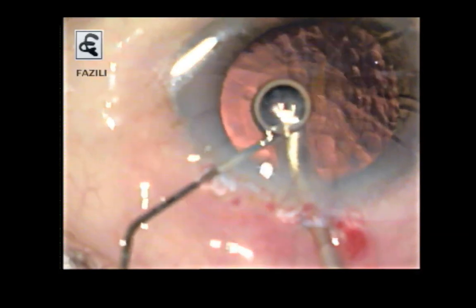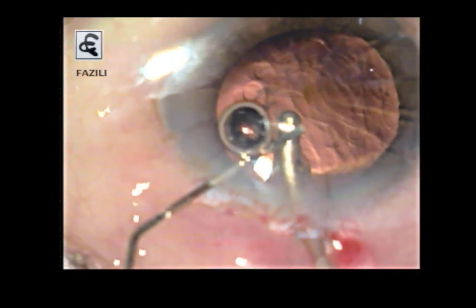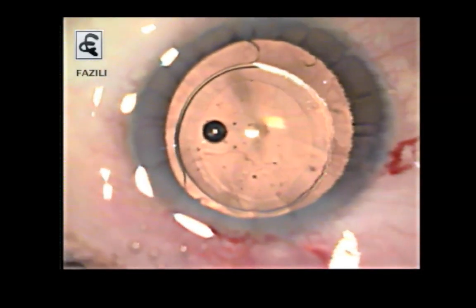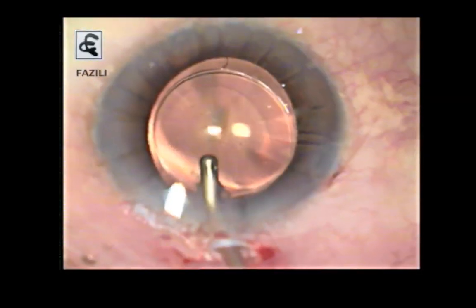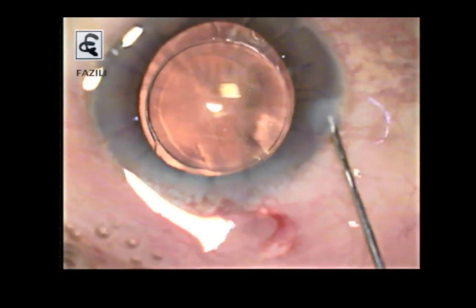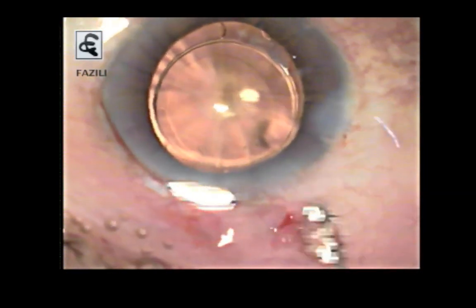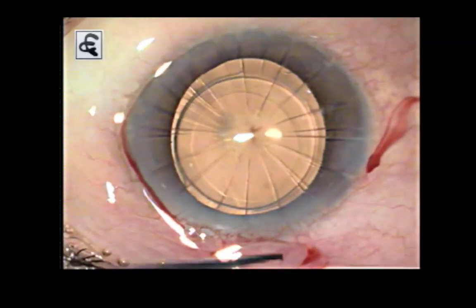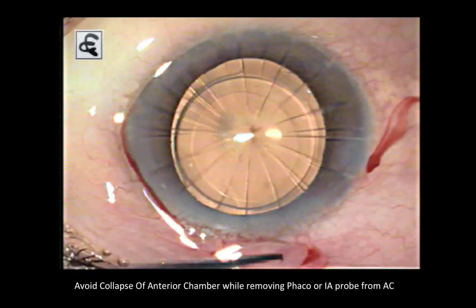So these people might not have very thick glasses. You have to keep in mind that the corneal correction does not make the behavior of the eye any different. It's going to behave during the surgery the same way as any other myopic eye would. The only thing in patients who have radial keratotomy done is that you will always have to have a look at the end of the surgery at these keratotomies and see whether they're leaking. Sometimes they even have to be sutured. But there's an edge and advantage of using a scleral incision in this, because these incisions at least do not.